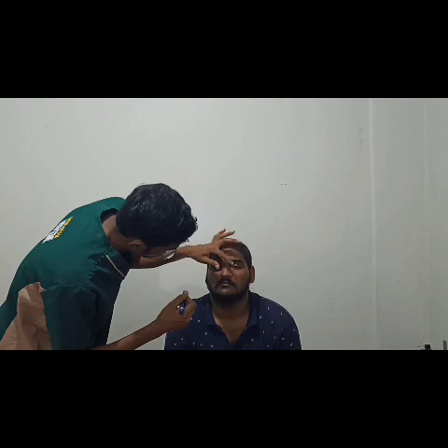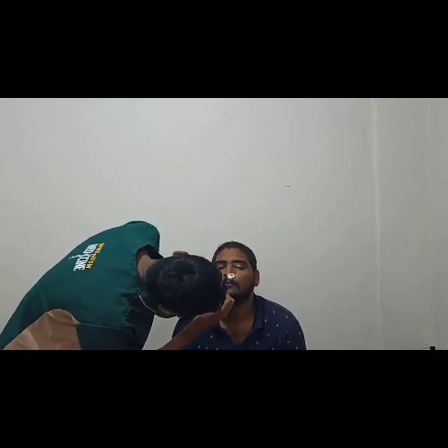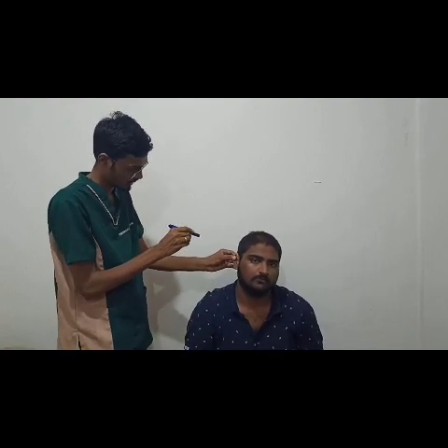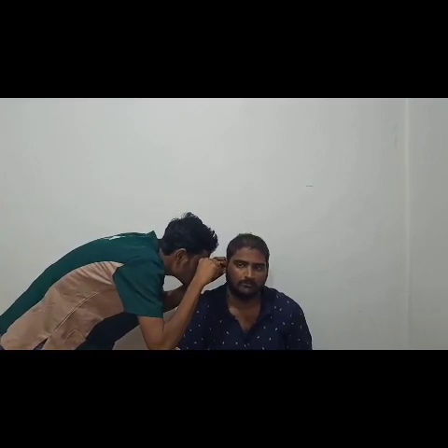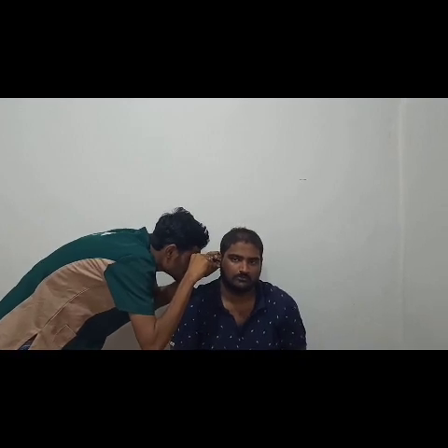Okay, now we are going to perform nose examination. Inspect the nose of the patient, nasal flares. Look for any nasal deviation, nasal septal deviation. Perform ear examination. First check the outer ear, pinna. Look for any scars or lesions or any asymmetry. And with the help of otoscope, check the tympanic membrane. Look if it is bulged.